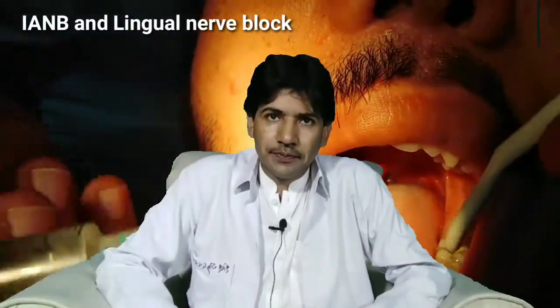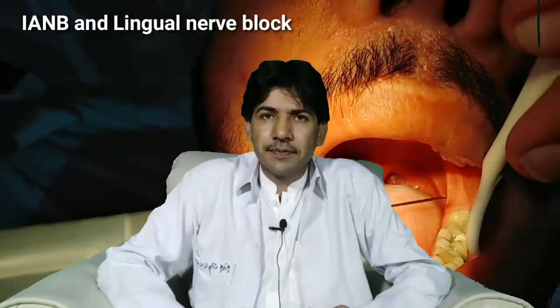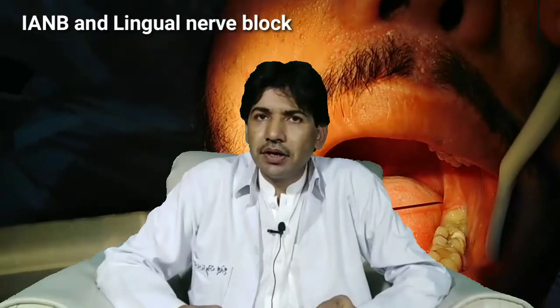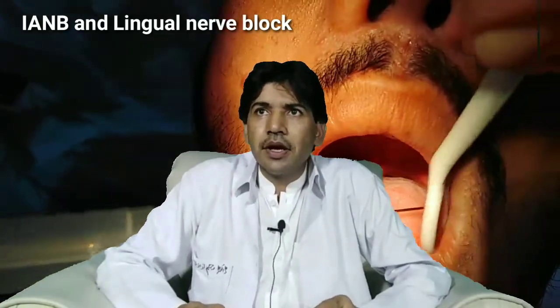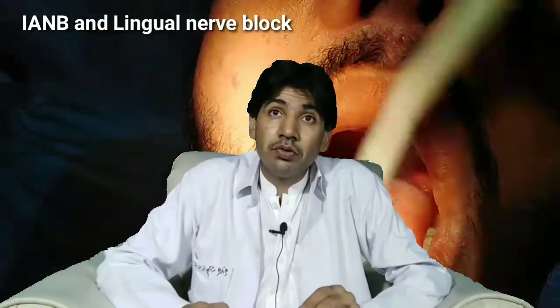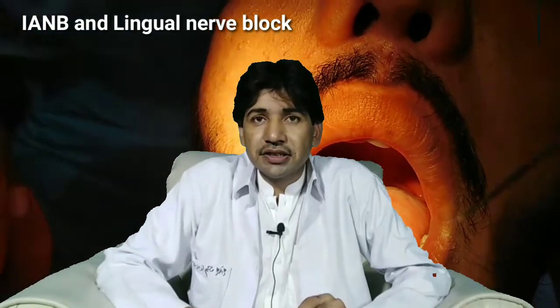Bismillahir rahmanir rahim. Today's topic is the inferior alveolar nerve block. In this video we'll talk about the inferior alveolar nerve block and the lingual nerve block, and we'll see practically how to perform it. What is the injection technique?